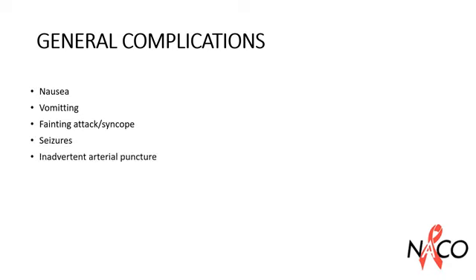General complications can be nausea, vomiting, fainting attack or syncope, seizures, inadvertent arterial puncture, and nerve damage. Sample related complications can be hemolysis, clots in anticoagulated specimens, and platelet clumps.